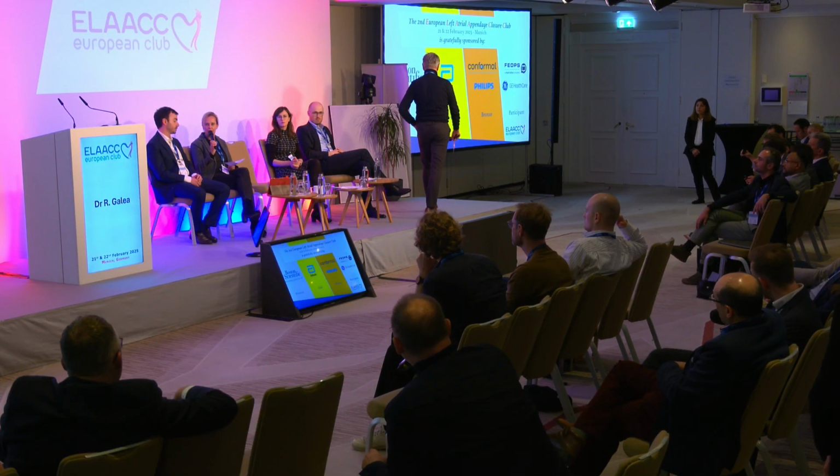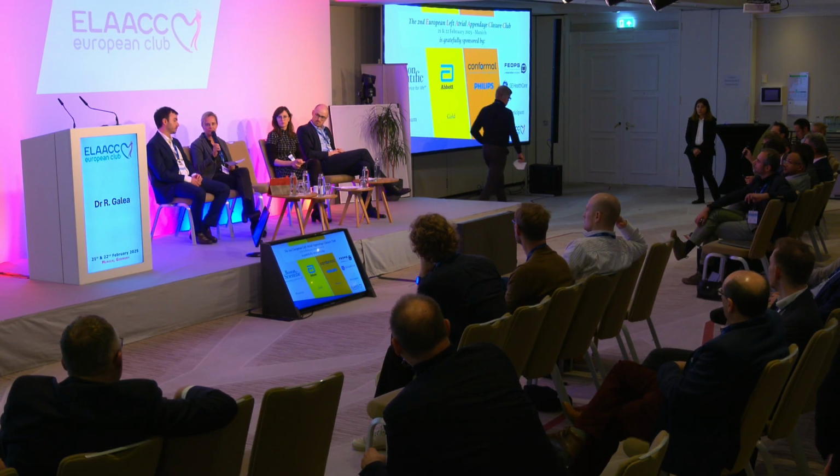So, Sven, I don't have the exact number in mind. Were there thrombi during the anticoagulation period of PROTECT AF, do you remember? Because I think the development of thrombi under anticoagulation was very low. But you have this jump, it goes up if you discontinue anticoagulation. I would think that the first TOE after 45 days was to look if there are gaps larger than 5 millimeters, because the protocol states that when you have a gap of more than 5 millimeters, you cannot stop the anticoagulation. This was the first view on gaps, not really on device-related thrombus.